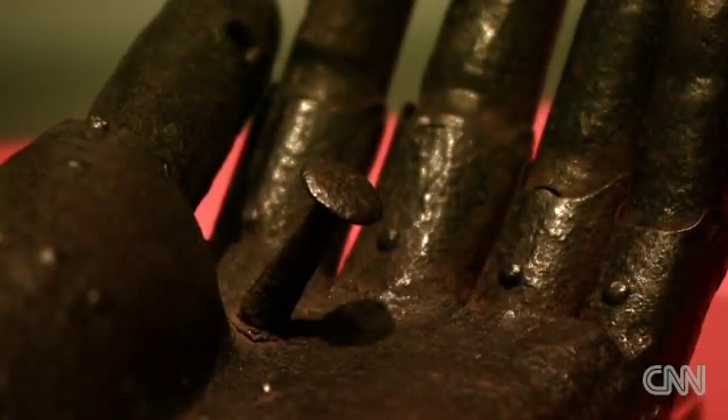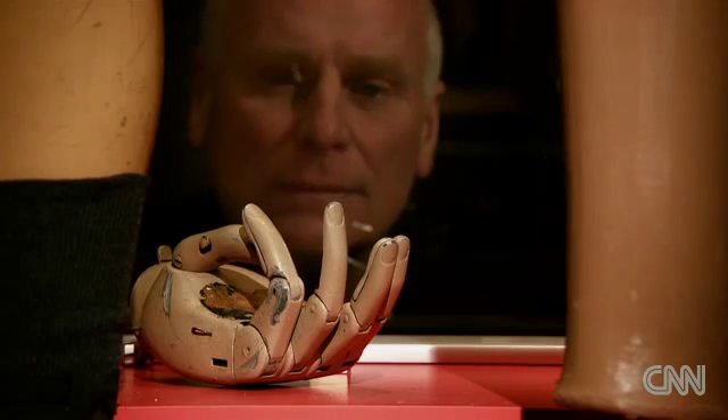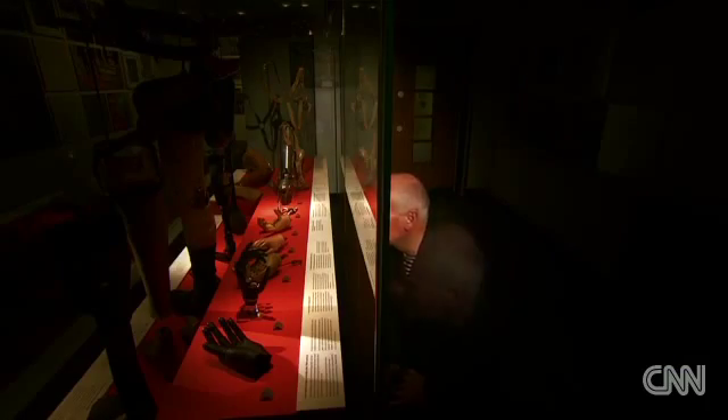We've used a whole variety of materials to make artificial limbs in the 20th century. These days, the science has made a great leap forward. Prosthetic hands are now able to do pretty much what a real hand can.